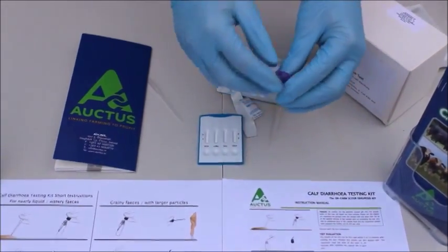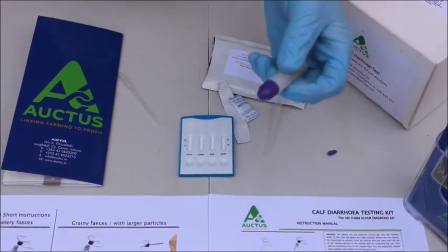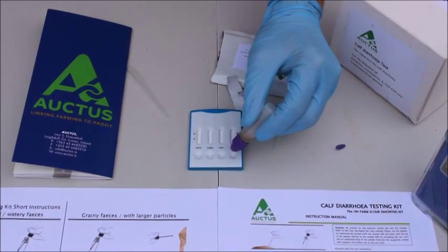We then take the solution, break off the nib at the top of the sample bottle, and drop two drops of the solution into each well.